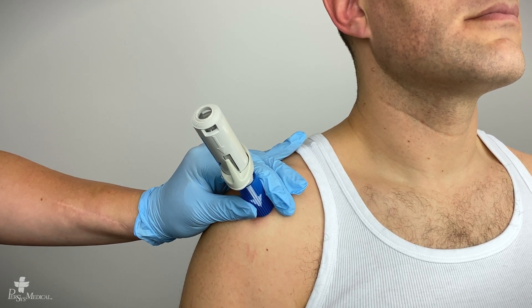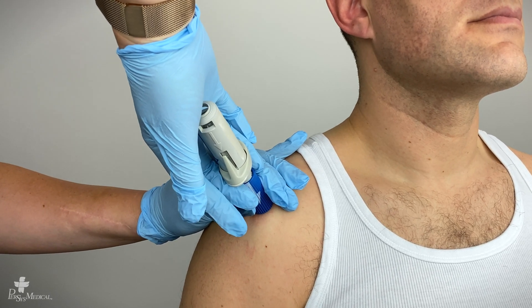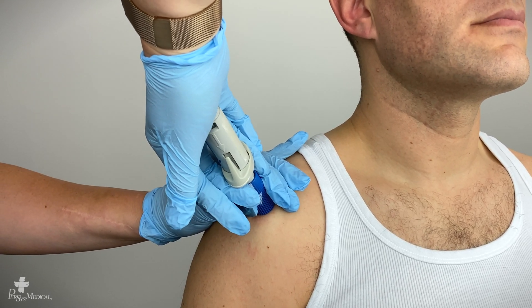While holding the bottom against the patient's skin firmly, press down against the BIG. This will deploy the BIG.